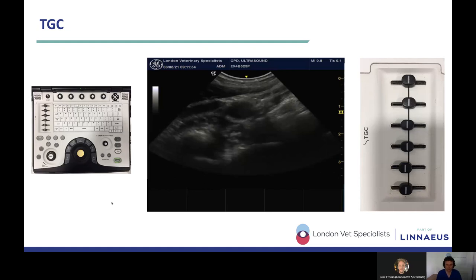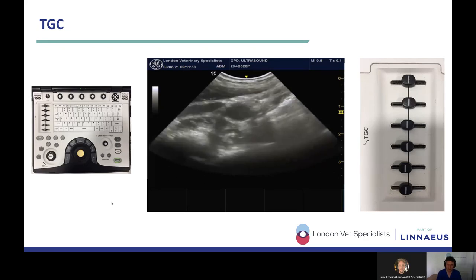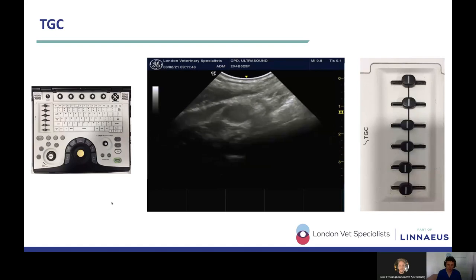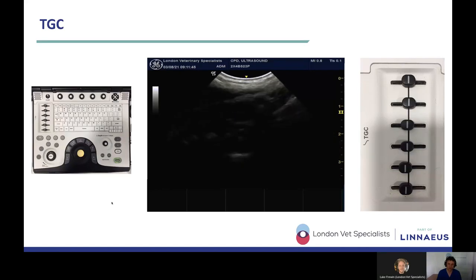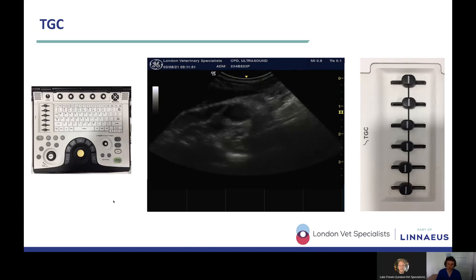So let's take another look at that. That's the top sliders going from left to right, going up right the way from the near field to the far field. And now I'm doing it in the opposite direction, right from the bottom to the top, going from right to left on the sliders. So that's what your time gain compensation does.